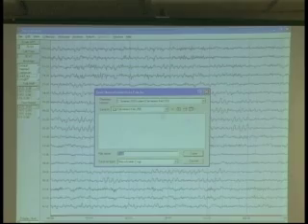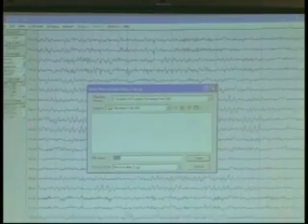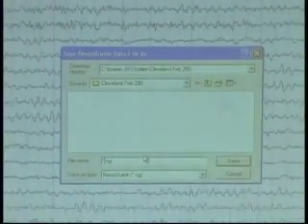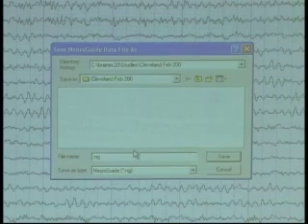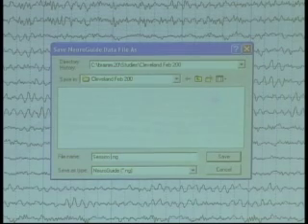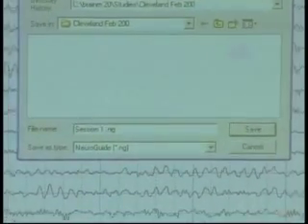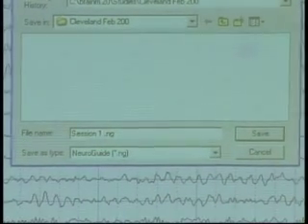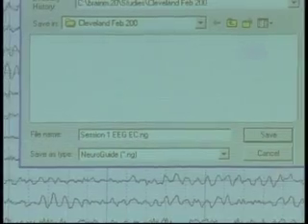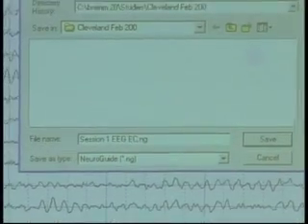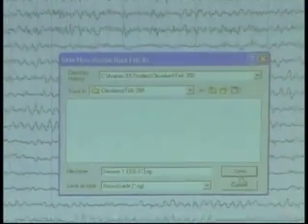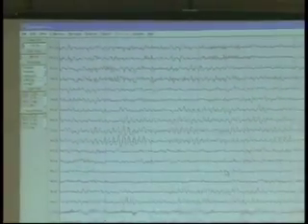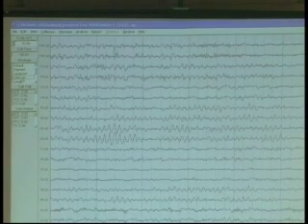NeuroGuide. We're back in this nice browser. So now we will type in Session One, EEG, Eyes Closed. This will be a NeuroGuide file. We hit Save. And now that's saved.